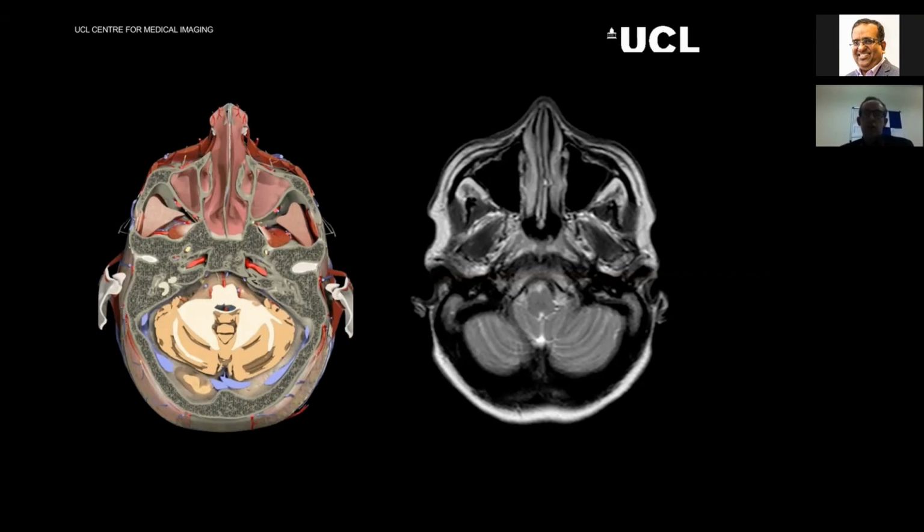So in terms of trying to work out what your set pieces are, we all talk about, okay, well, you should be able to rattle off cavitating right upper lobe masses, or left lower lobe collapse. But my first tip for you would be that for neuro there are set pieces too. You're always going to see something. So the top three differentials in the cerebellopontine angle strikes me as the first one.